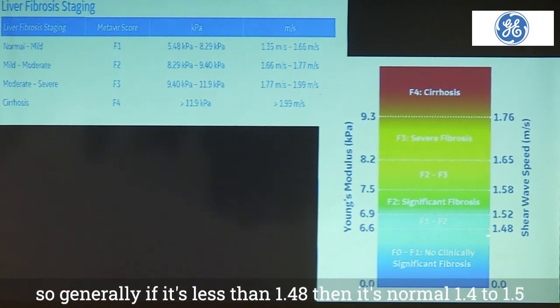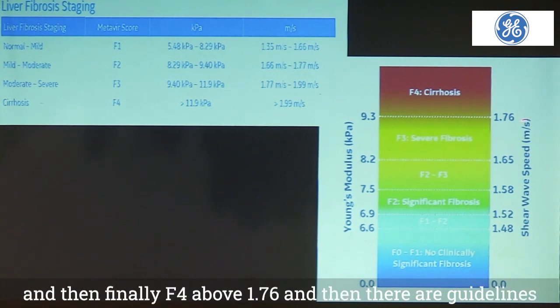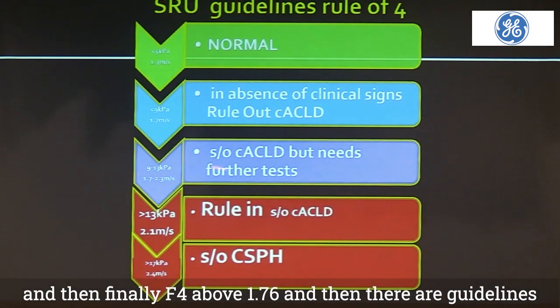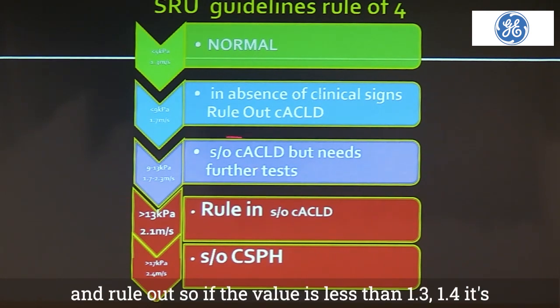Generally, if it's less than 1.48, then it's normal. 1.4 to 1.5 is F1. These are incrementally increasing, F2, F3, and then finally F4 above 1.76. And then there are guidelines of how to manage these cases, the rule in and rule out.